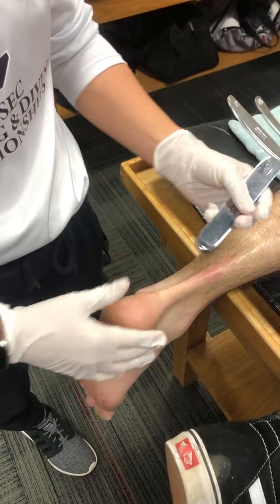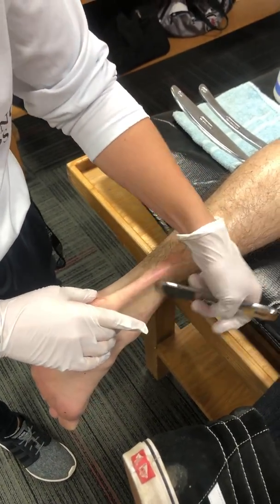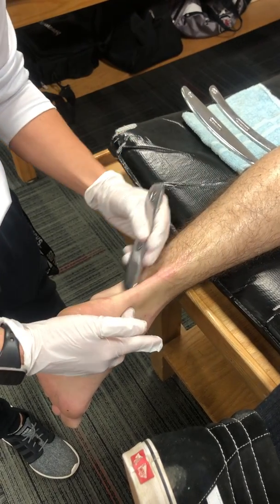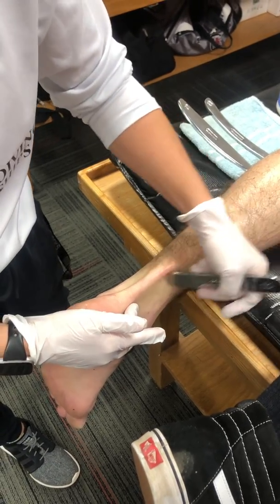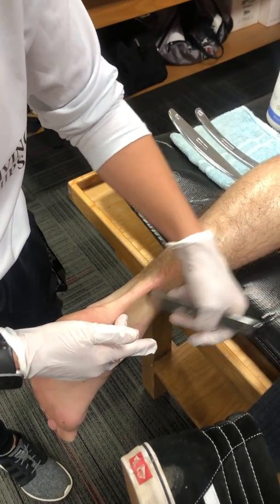With the GT3, you go in at a very soft angle so you do not hurt the patient, going along both edges and working through the curvature of the actual Achilles tendon to get all those little details.